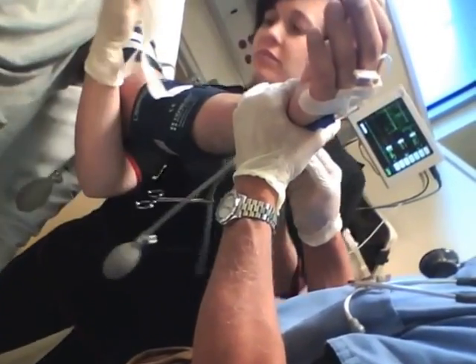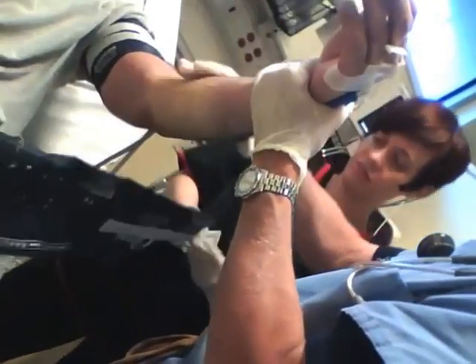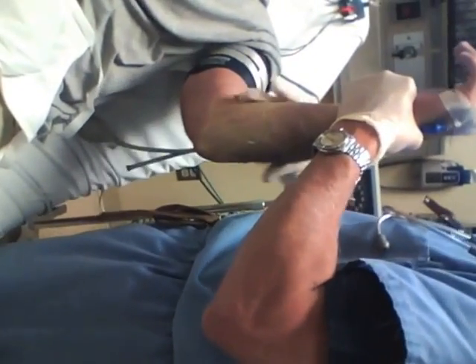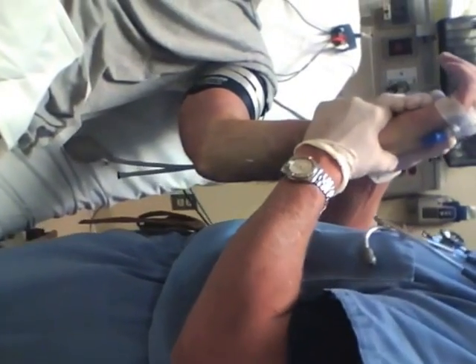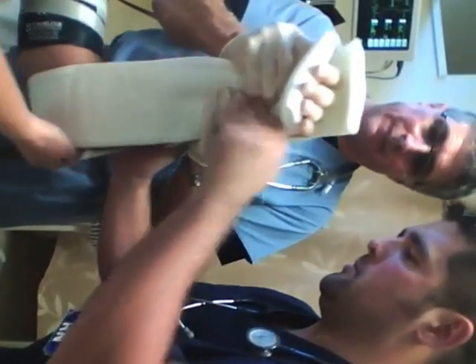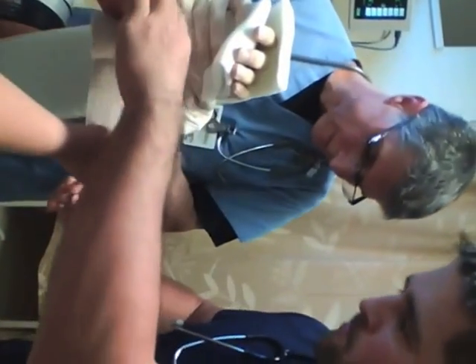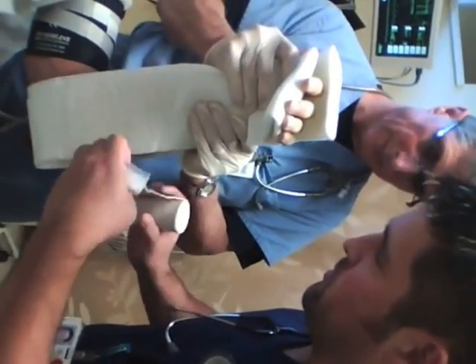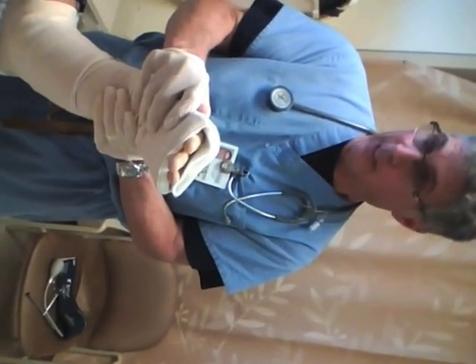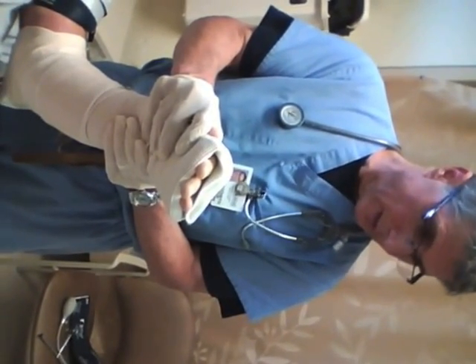After at least 20 minutes — and preferably a little bit longer — of isolation of the extremity through the arterial tourniquets, the tourniquets can be deflated and removed. It's generally best to slowly deflate the tourniquets to allow blood flow to ease into the hand rather than rush back into it. The intravenous catheter is removed and a sugar tong splint is placed on the patient following the reduction. The patient's arm will remain anesthetized for up to an hour or longer with lidocaine, and for up to six hours if bupivacaine is used.